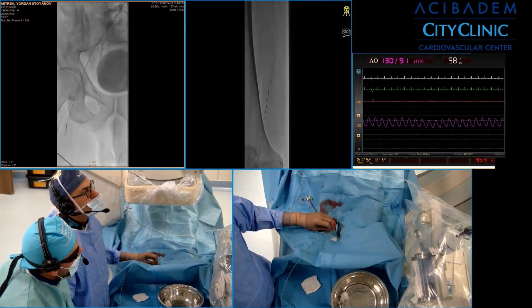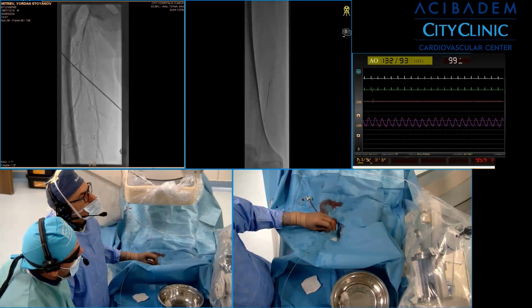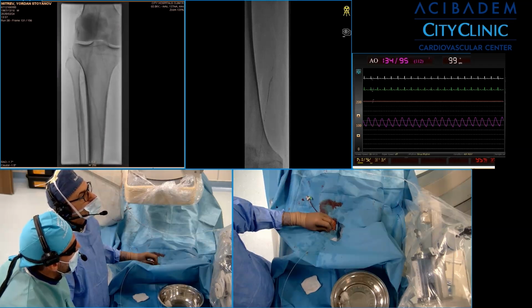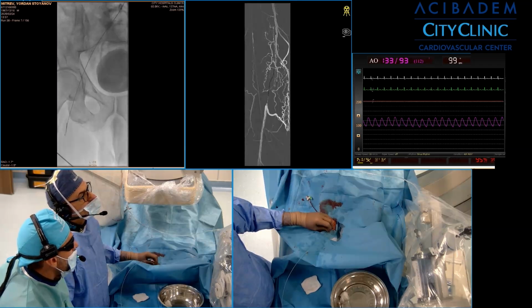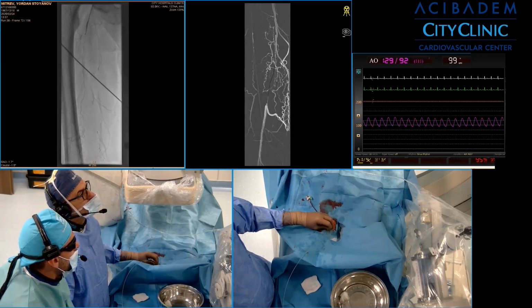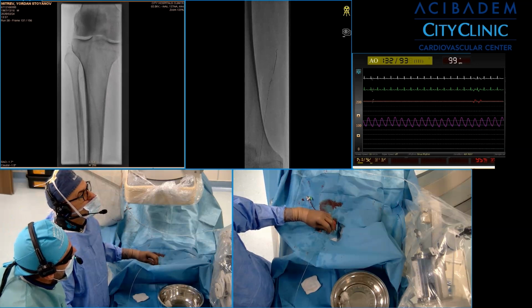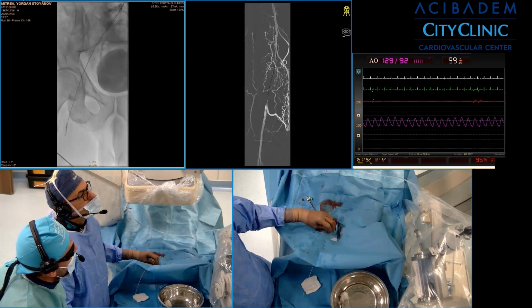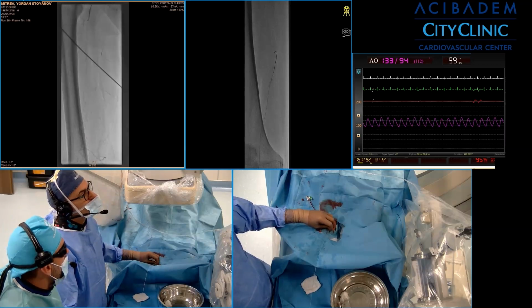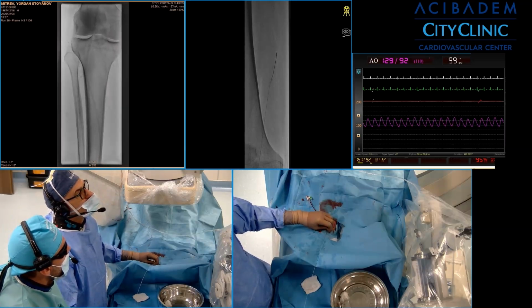Crossing from here. There is a calcium roadmap there. It's probably the intermediate cap. Yes, this is different. It's a different place. And now this is the proximal cap. Okay, I'm advancing the microcatheter just beyond the proximal cap. Try.